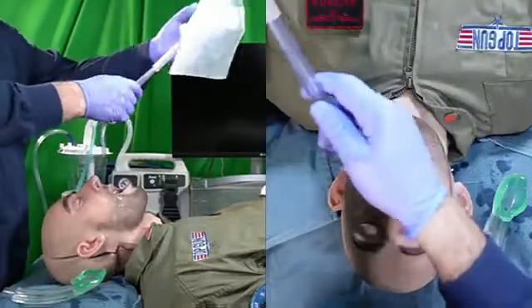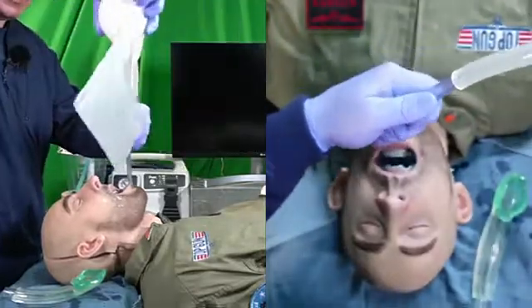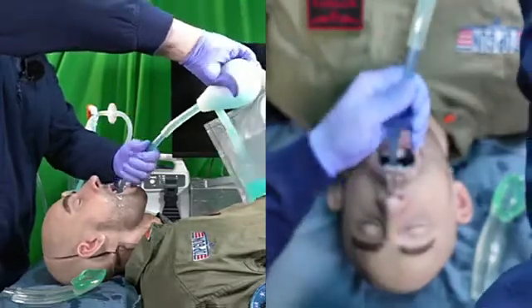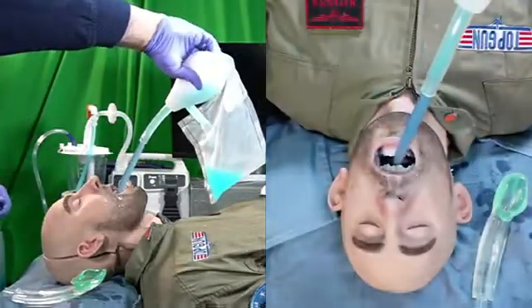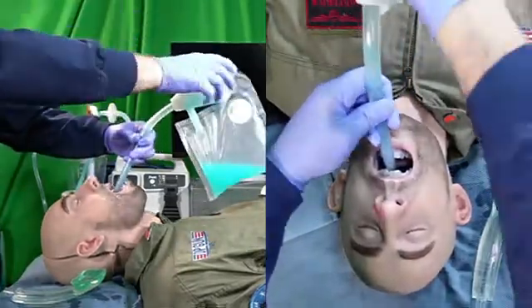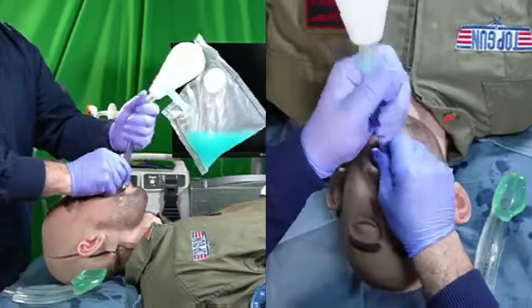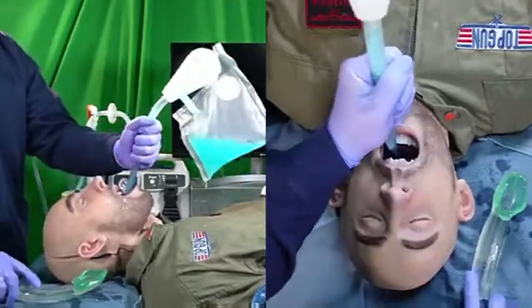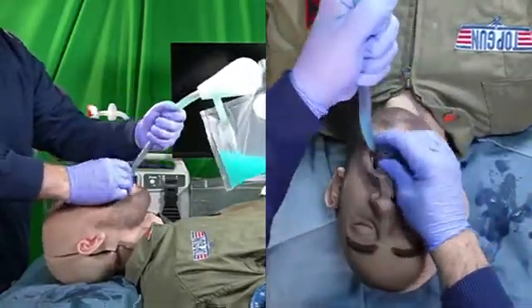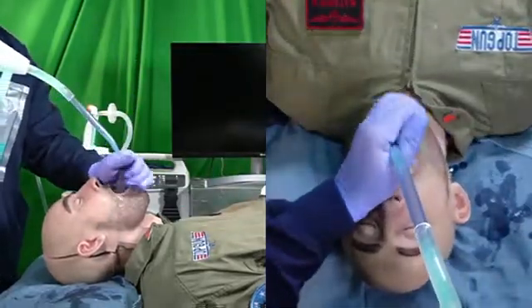I'll begin by introducing the Ducanto catheter into the mouth and squeezing and releasing this bulb, which is very effective in evacuating airway contaminants. And what I'll do now is I'll push this rigid suction catheter into the floor of the mouth to distract the tongue into the floor of the mouth and lift the base of tongue off the posterior pharyngeal wall. I'll place the supraglottic airway fully into the patient, and I'll finish the insertion with the rapid airway decontamination maneuver.